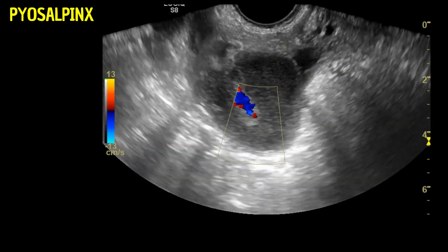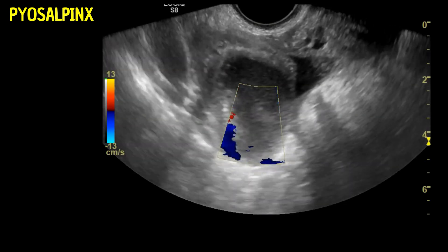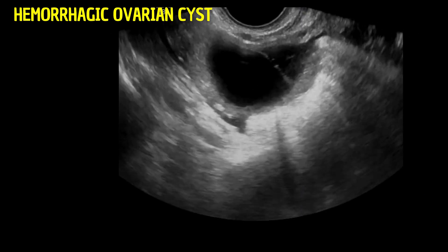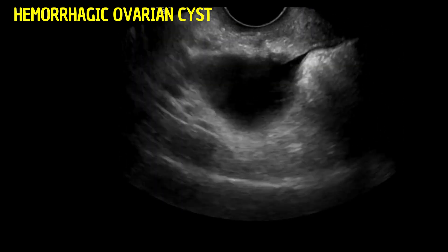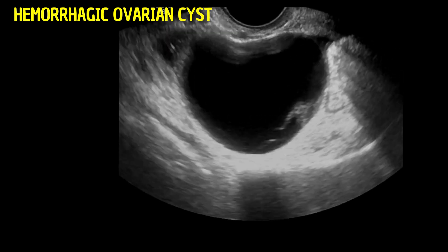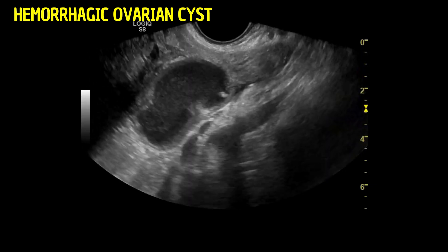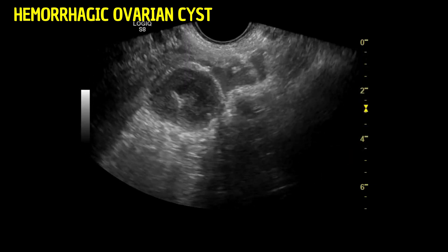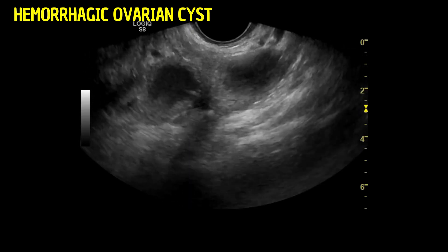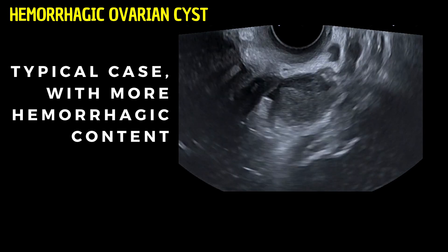Having observed these distinctive features of pyosalpinx, it's imperative we now consider the differential diagnoses to ensure a comprehensive evaluation. In this case, we observed an ovarian cyst in the adnexal region with minimal hemorrhagic content, posing a distinct diagnostic challenge. Its location, notably farther from the uterus, along with its thin walls, more rounded shape contrasting with the tubular appearance of a pyosalpinx, and the hemorrhagic content were key in differentiating it from the adjacent salpingitis. I'll now show you a more typical hemorrhagic cyst, highlighting its differences such as multiple complete thin septations, which further underscore its distinct characteristics.